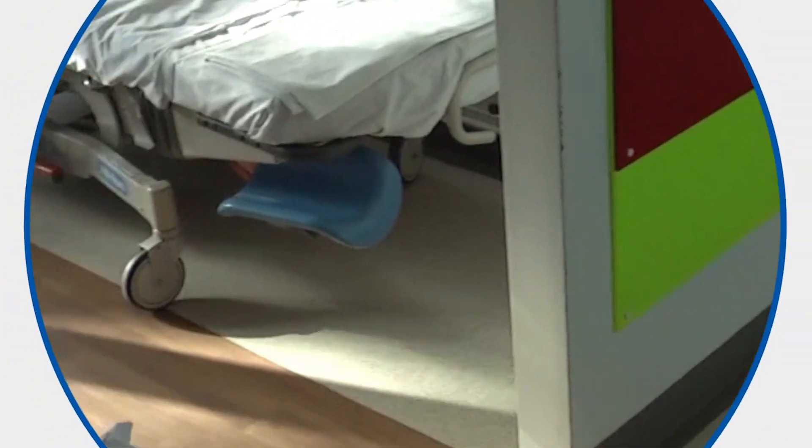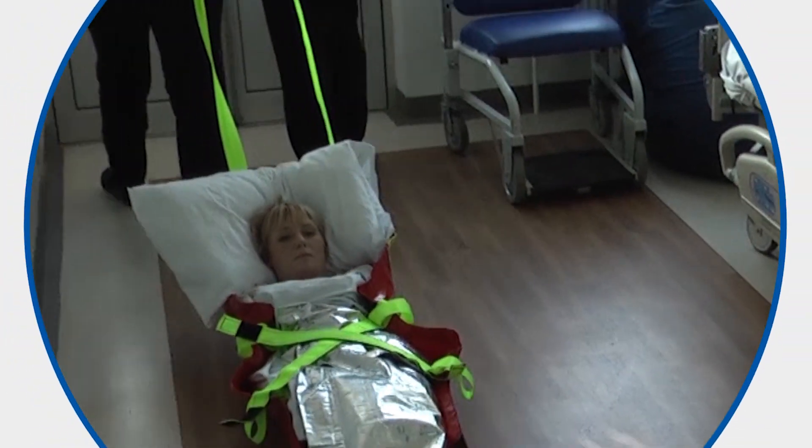Once the user has exited the building and reached a point of safety, the cross straps can be loosened to ensure the user is comfortable.